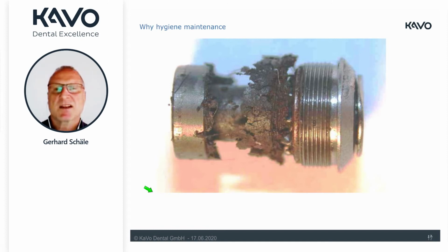The only possibility, if the instrument is not defective right now, is that we can open the instrument in the service, clean it and try to keep the instrument alive. But a circumstance like this, we should avoid exactly this case here.